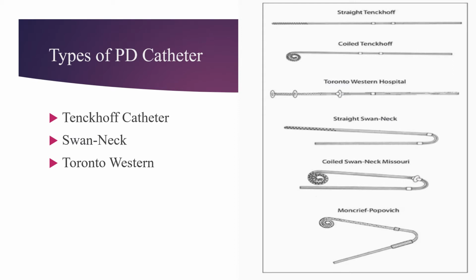The standard catheter for PD is made of silicone, which is a soft tubing for comfort. It has cuffs made of a polyester material called Dacron that merge with your scar tissue to keep it in place.